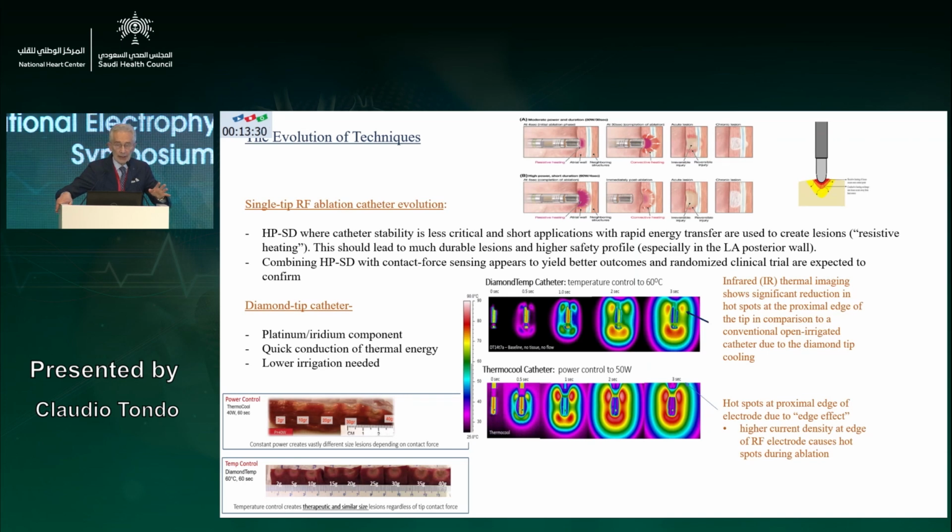I don't use high power short duration right now for posterior wall isolation, nor do I use the diamond catheter for catheter ablation anymore, but it's a good catheter.